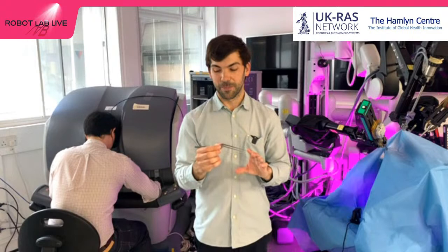And another thing that they can do is to enhance the possibilities of the surgeon, to make them perceive more than we as humans can do. And if you think about very, very tiny and delicate things in our body, things that in order to grasp them, we wouldn't be able to perceive the force that is applied. So we can create a tool like this, embed an amazing set of electronics in here that would make it look much cooler than it does right now. And this tool would allow us to perceive forces that otherwise we are not able to perceive.